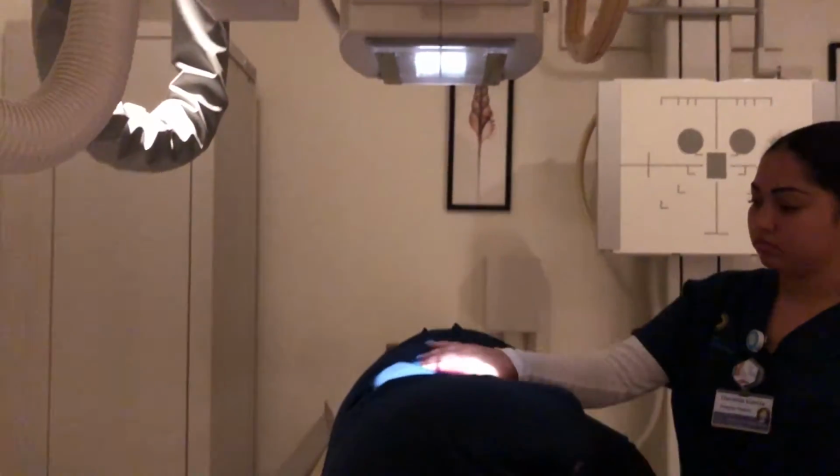We're still going to center at L1-2. This is, again, for a sthenic type patient. Body habitus does mean a lot when you go positioning for these. So you don't need any light on the table in the posterior part. Basically, this is her spine right here, so everything's going to be anterior to her spine. We actually can go back a little bit more anterior, and that would be right there. So again, centering at L1-2, and what we're looking at in this is the retrogastric space.